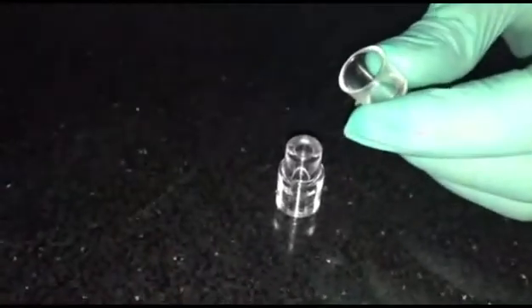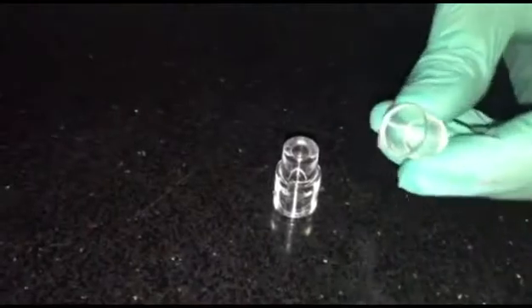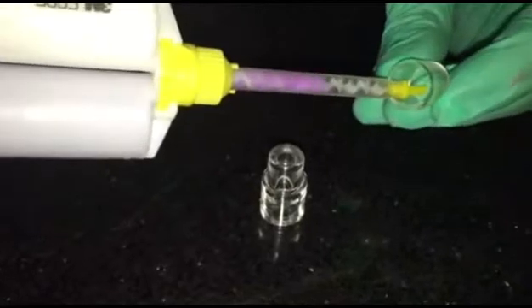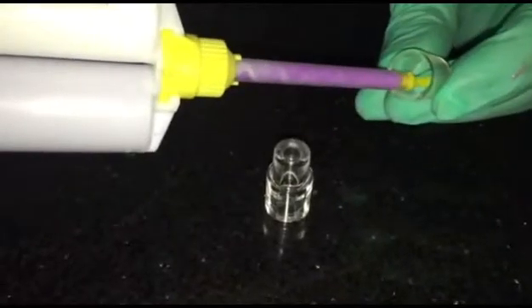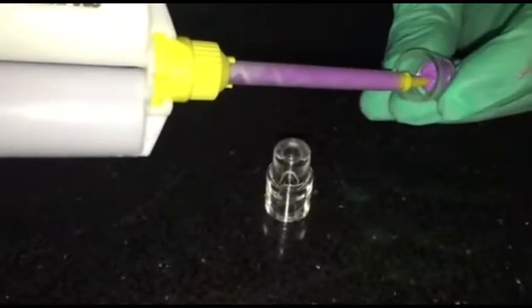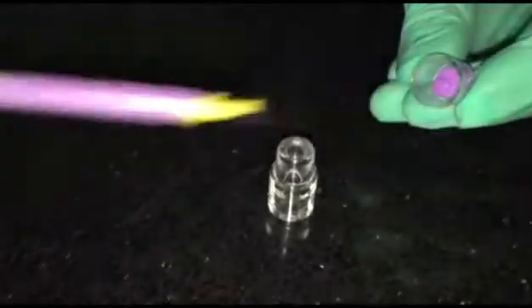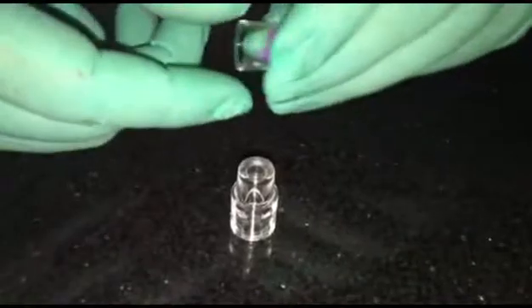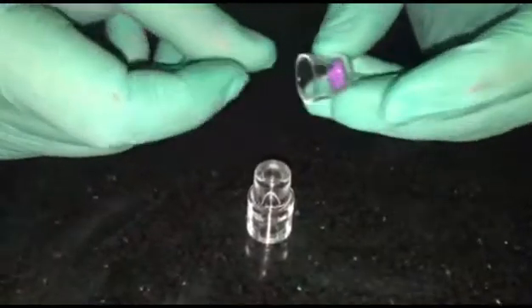Here I'm going to fill only the base of the crown. That's it. Appreciate that this is a very little amount of, say, GIC for example that I have used - very little.